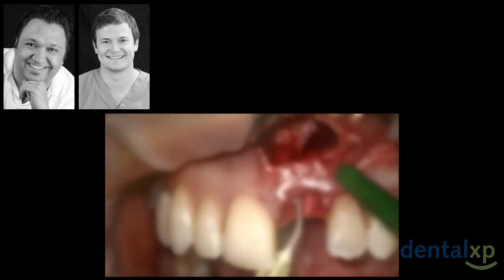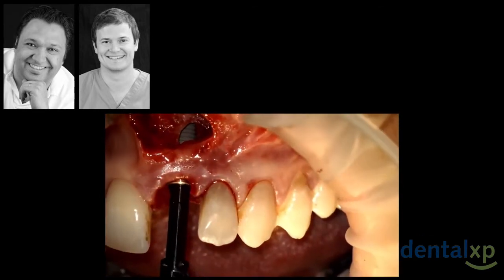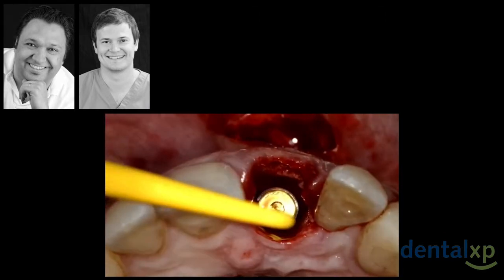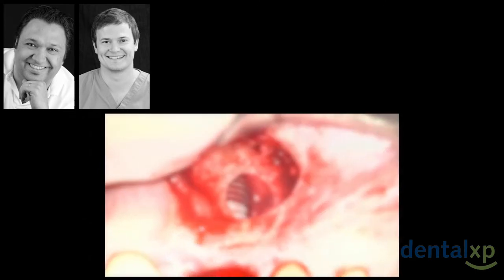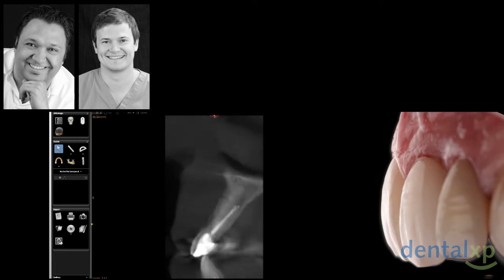You see that the surgical procedure that we have chosen is almost the same as for an endodontic microsurgery, and that the implant that is placed is just anchored in the remaining bone above the lesion. You can see that the implant placement is correct. The implant position is okay in the 3 dimensions of space, and it will lead to a good aesthetic outcome, because you see the picture 1 year down the road after the surgical procedure, at the crown placement, we got a very nice aesthetic outcome.